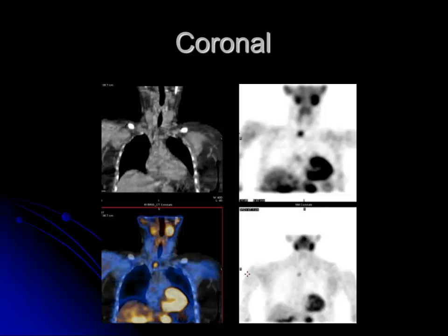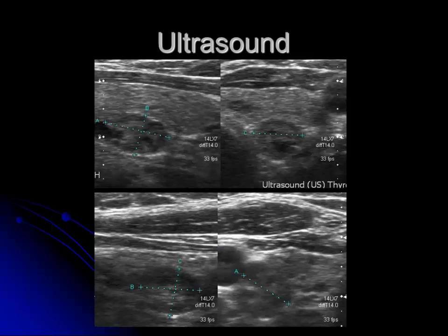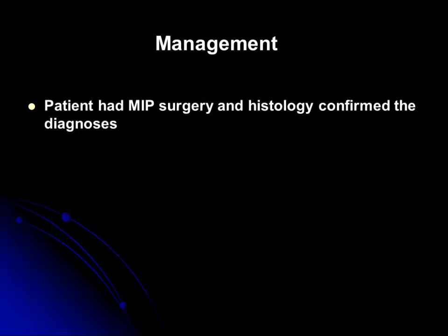Same patient in coronal projections. The ultrasound shows the adenoma localizing in the exact site. Management: the patient had minimally invasive parathyroidectomy, and histology confirmed the diagnosis.